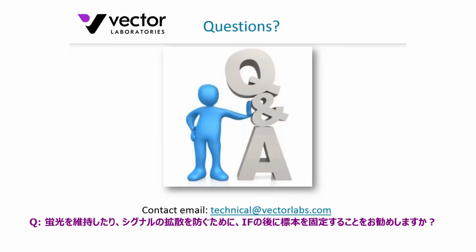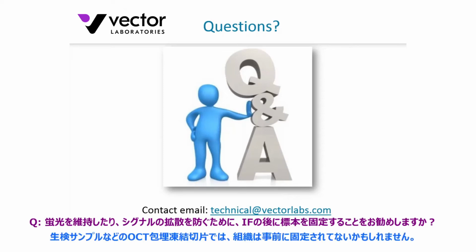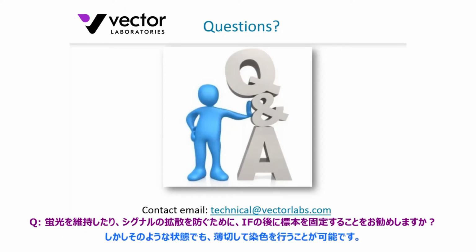Let's just say it's a tissue section that's been cut. It could be embedded in OCT, might be from a cryostat. You'd cut it. Maybe the tissue itself was put in as, say, a biopsy or something like that, fresh frozen and not fixed before it was frozen. Certainly you could do that. You could go through those parameters.